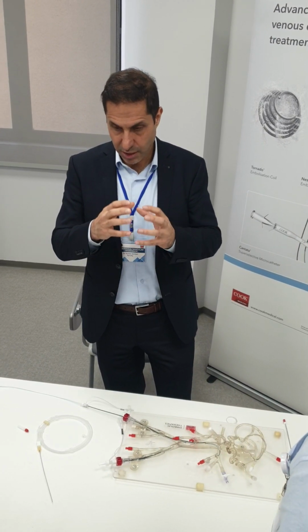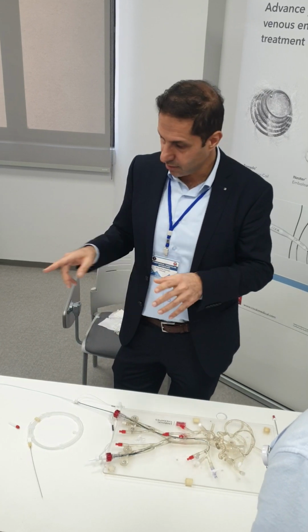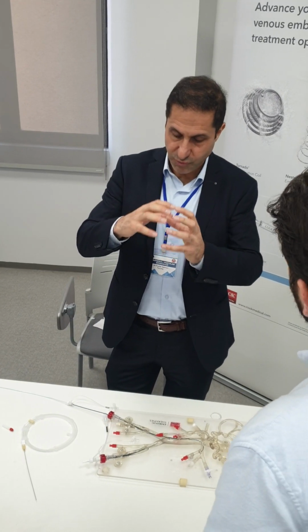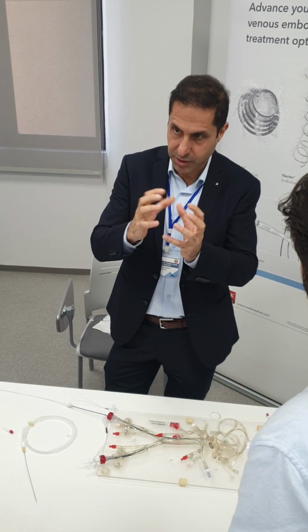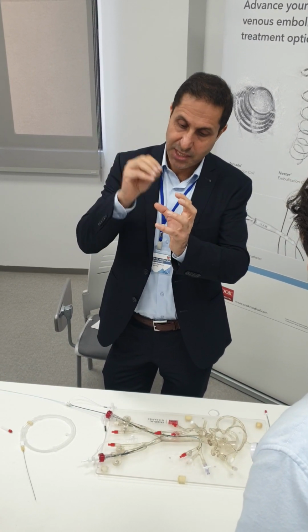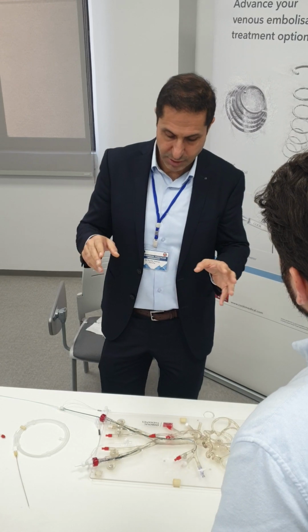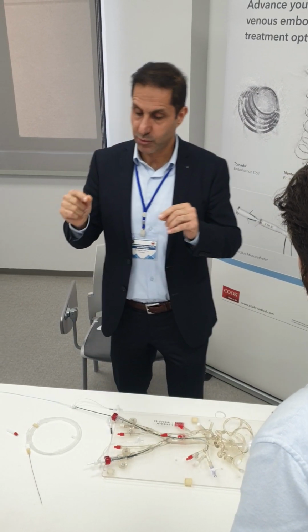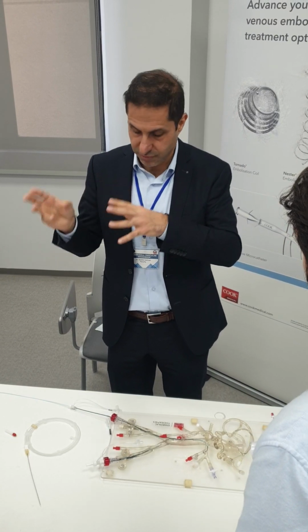When we are coiling aneurysms, we need framing coils first. We call them 3D coils. They are not available here. So you form a cage or elliptical according to the shape of the aneurysm first, and inside it you can pack other coils, 3D coils or 2D coils, it depends. So when we are talking about coating of the coils, we have different types as well.